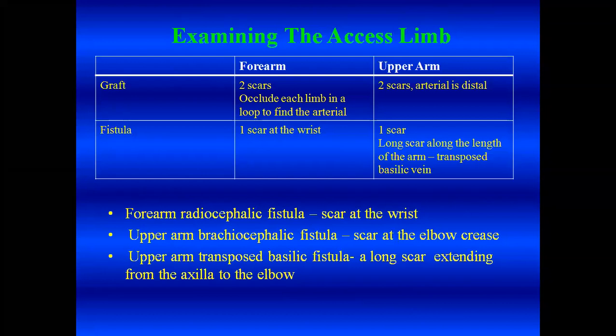When we occlude the venous limb, if we palpate the arterial limb, it augments. And if we occlude the arterial limb, then obviously no thrill or pulsation is felt in the venous limb. Now, unlike an AV fistula, where you have a length of vein to cannulate and it doesn't really matter where you cannulate it, in the arteriovenous graft, whether it's a synthetic graft or a saphenous vein graft, it's necessary to know which is the arterial inflow and which is the outflow limb in order to direct the needles appropriately for doing dialysis.